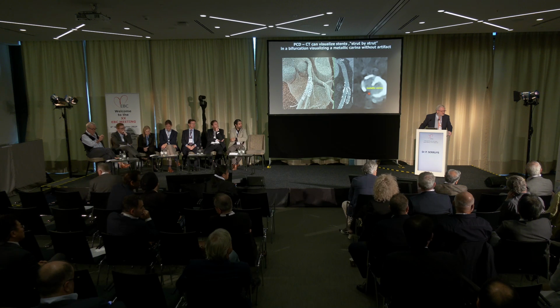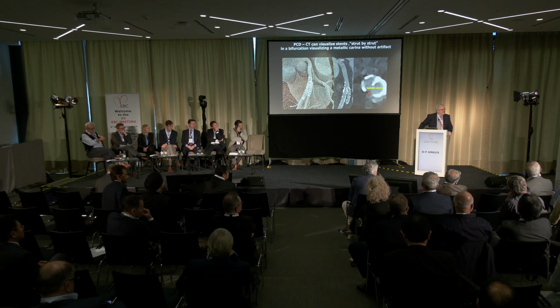Incredible presentation, Patrick. So, I have a very practical question. When we are looking at the coronary angiography today, we are correcting the measurement we have by 5%. You know, this is a work you did with Kubo a long time ago. With the photon counting, the diameter that you will have, does it have to be modified or not?